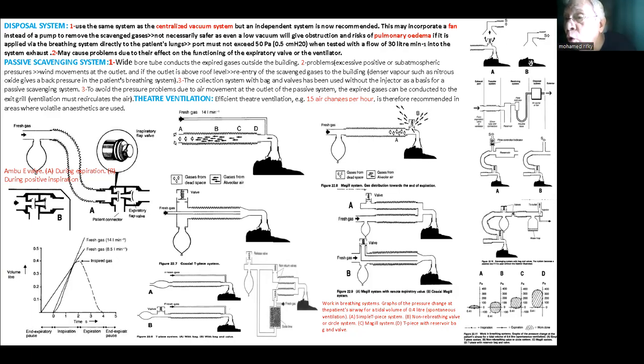It ought to be close by to the patient, of course, and it ought to have a proper flow to minimize the pollution. Of course, this funnel can be reversed downwards the opening of the T-tube. You see, you can use it to collect instead of putting the funnel in the proper situation to remove what is present.